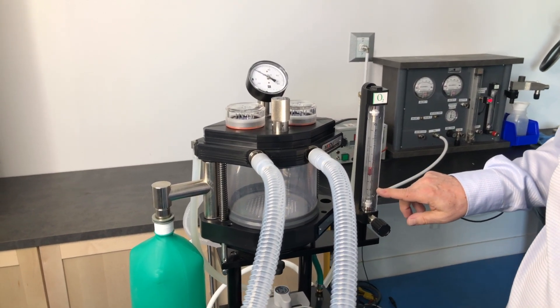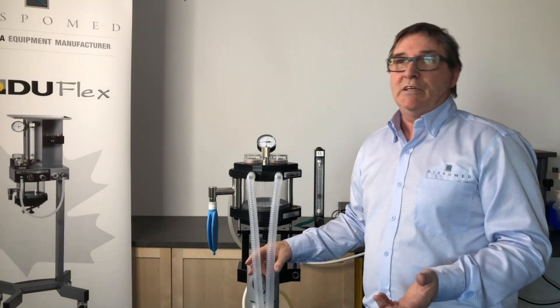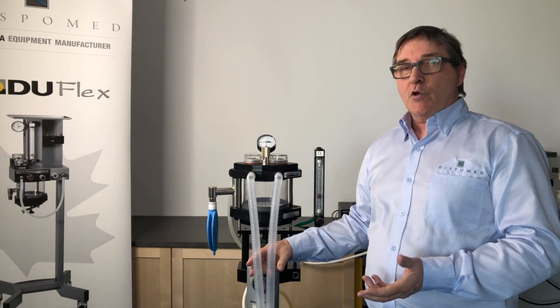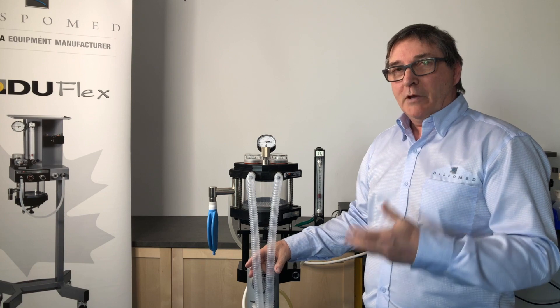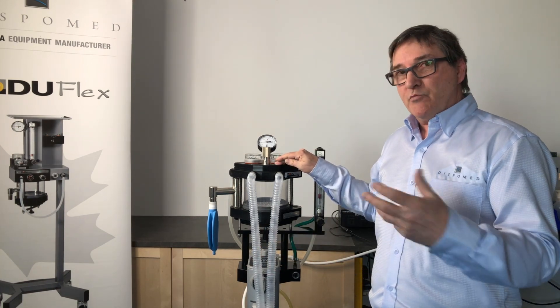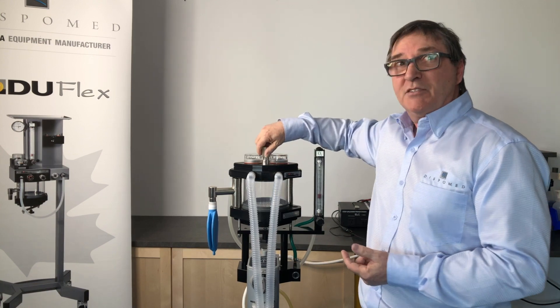If our leakage is higher than 200 milliliters, the leak is too big. Now, we did our leak test and corrected all of our leaks. Are we ready to use our anesthesia machine? When we're working with our patients, our patients are breathing spontaneously, so the pop-off valve is open.